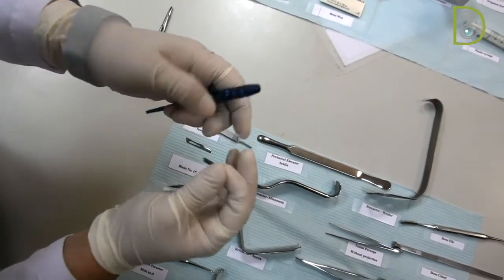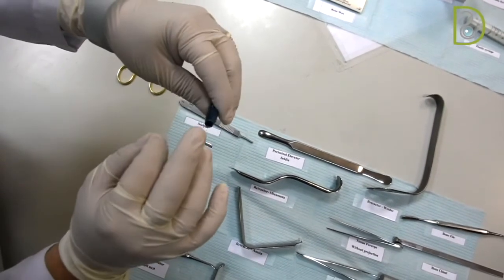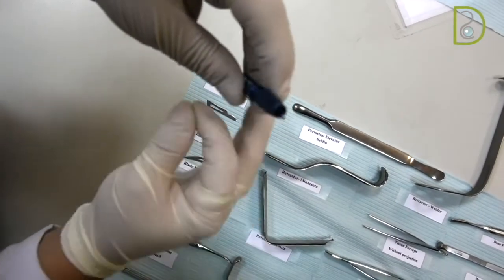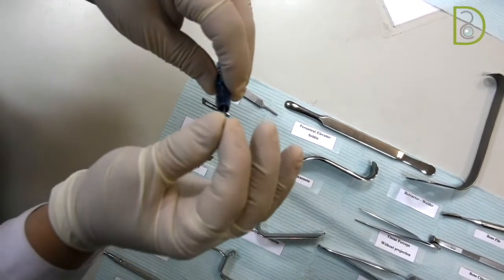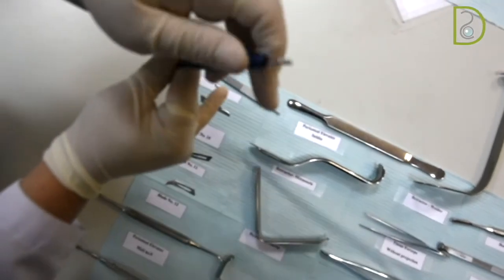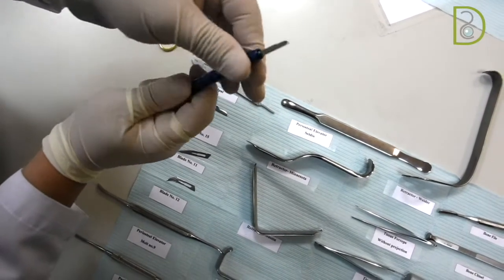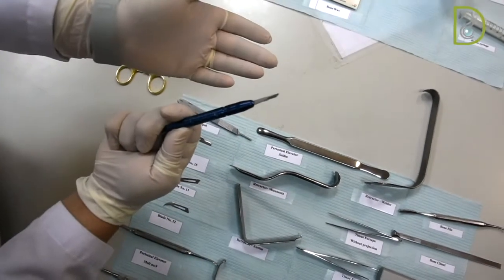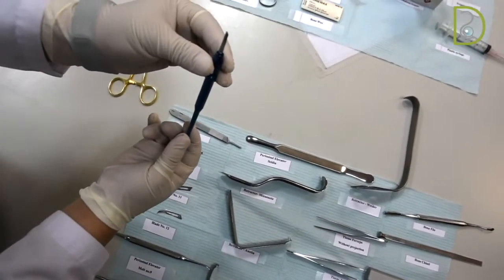And this one will be just rotated. And here in the middle, you can see there is a groove that will be enlarged when you rotate it anticlockwise. Then you will insert your blade, then rotate it, and slowly it will be attached and the grooves will be narrowed until it holds the blade in the right way. And this way, the blade will stay in its place. And this is the microblade holder.